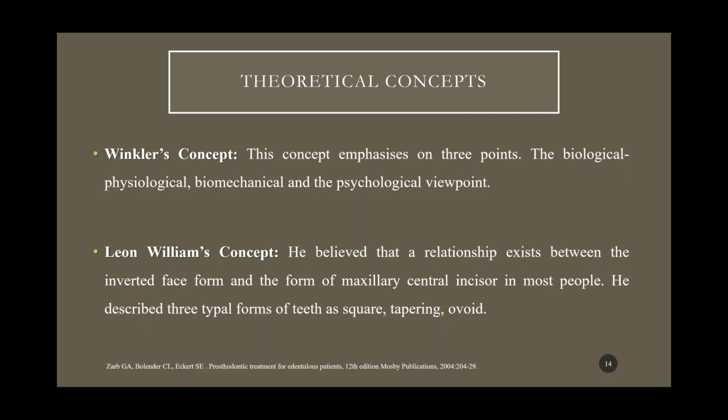The physiological point is that the facial musculature contributes to the aesthetics of the patient. So increasing the thickness of the denture base in the buccal sulcus area can produce a puffy appearance. So this should be taken into consideration, and the dentist should evaluate the perioral tissues and arrange the teeth accordingly.